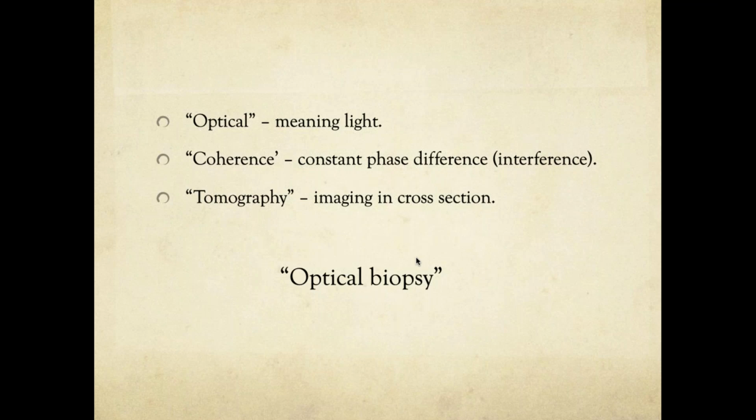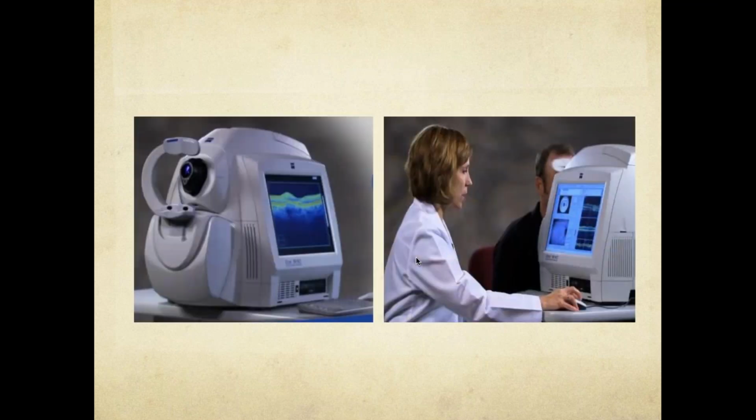So is that damage going to be a permanent damage, or is that damage going to be a temporary damage, or is it going to be reversible or irreversible? So that is another point that you have to focus on. So once you know the layers of the retina, it is the same thing that you will be focusing on in the OCT as well. So this I'm not going to discuss much about it.